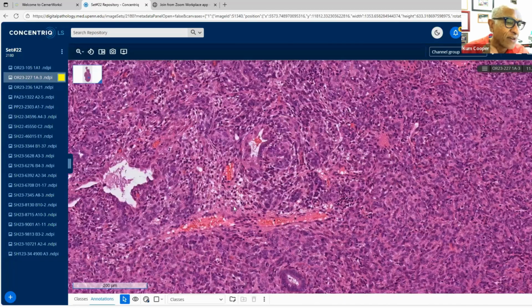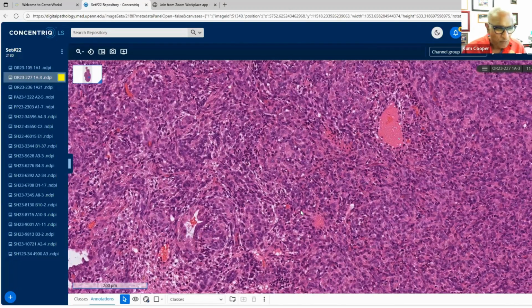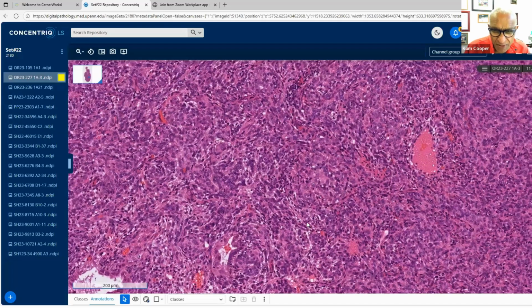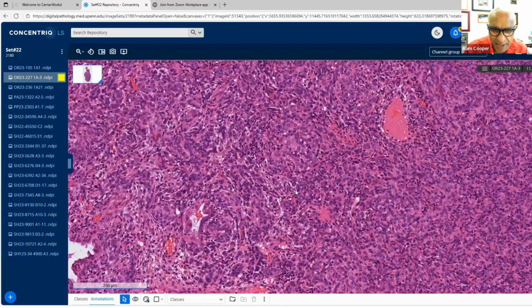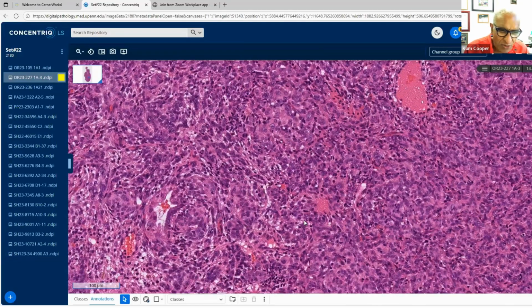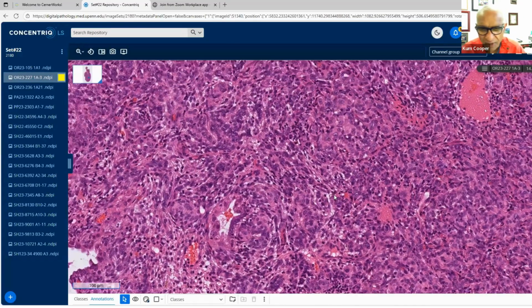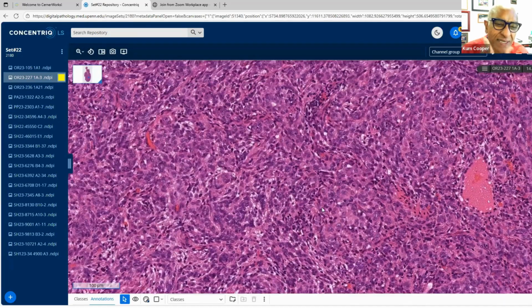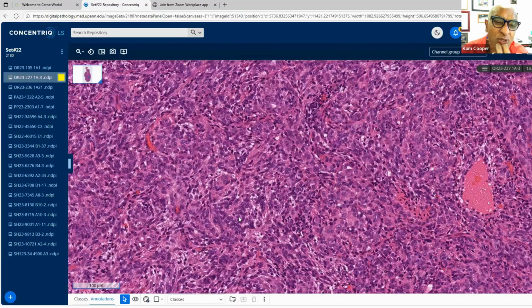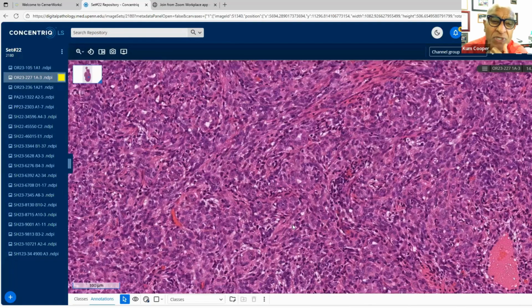There's another suggestion of a high-grade endometrial stromal sarcoma. Yes, you would consider that in your differential diagnosis because of the morphology. Now, high grade at this point, I would be a little reluctant to just go down the high grade route. I'd want to see more mitoses and atypia and pleomorphism, but let's keep it at endometrial stromal sarcoma. And if you wanted to go down that route, then again, CD10 is a useful starter. Some people use cyclin D1 as well. So that would be an option.